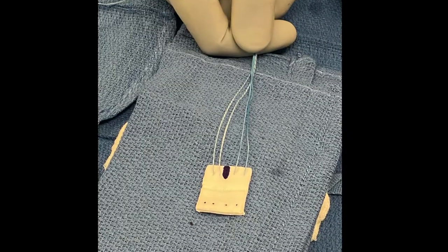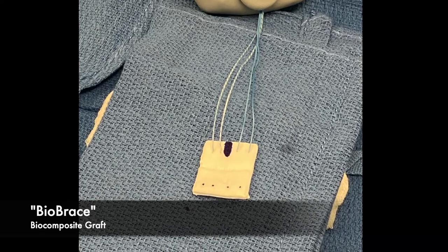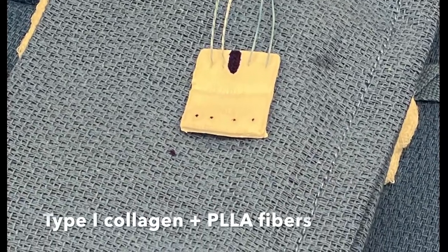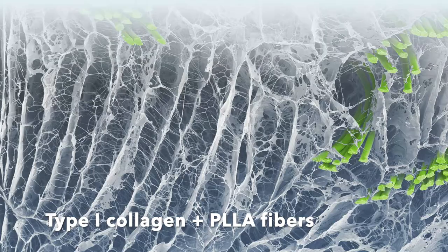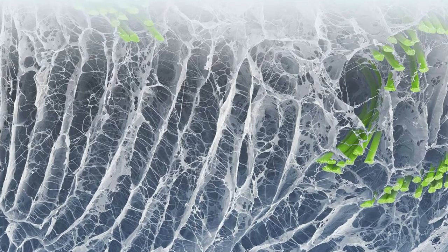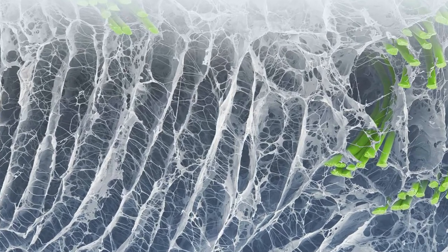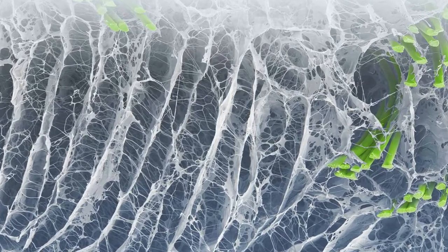At this point we bring in the BioBrace graft. It's a highly porous type 1 collagen implant augmented with PLLA fibers. The porosity allows rapid host cellular ingrowth and regeneration, while the PLLA fibers provide time-zero strength to the repair.